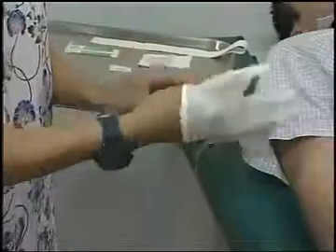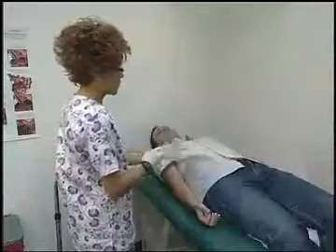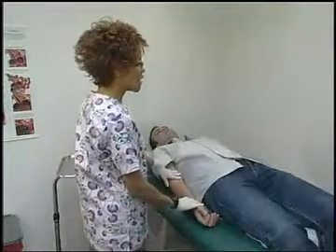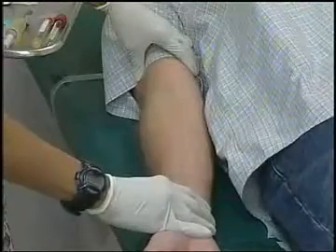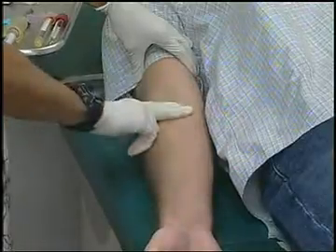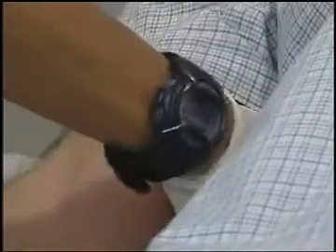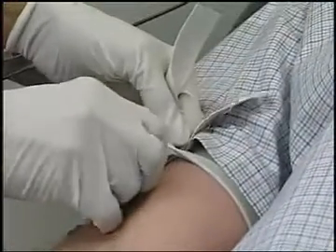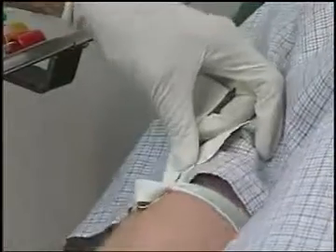Next, put on exam gloves. And place the patient's arm in an extended position with the palm facing up. The tourniquet goes about 2 inches above the antecubital space. The antecubital space is here, where the upper and the lower arm meet. Place the middle of the tourniquet on the elbow side like this. Crisscross the ends, and while holding one end stable, tuck the other end in. This creates a tie that can be quickly released with one hand.